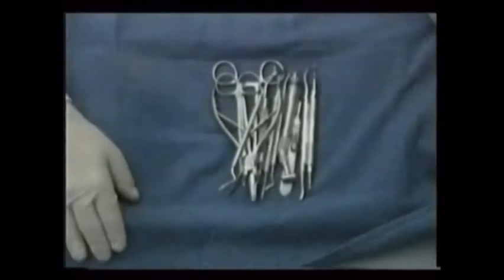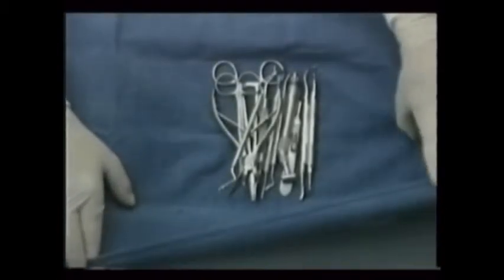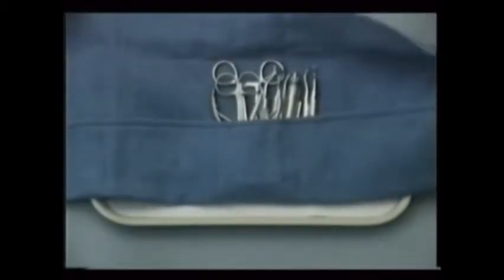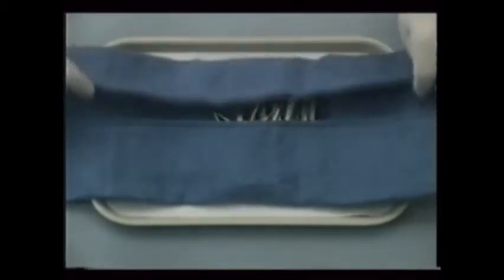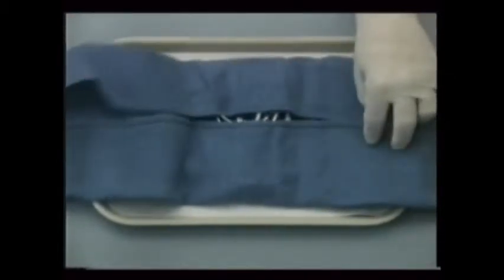Also, make sure the patient's face is clean before dismissing them from the treatment area. And finally, document the treatment in their record. Clean up the treatment area and properly recycle the surgical instruments and discard any disposables.